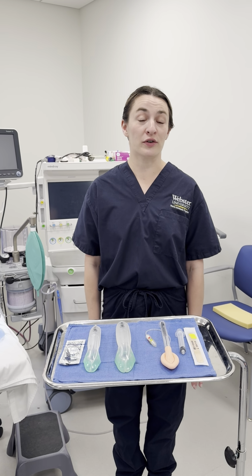The other times when these devices aren't the greatest are for longer surgeries that are hours and hours and hours long. At that point, you would just want to protect the airway and intubate. And they're also not recommended for positive pressure ventilation, because if you get over a certain amount of pressure, you can insufflate the stomach and then increase your risk for aspiration again, okay?